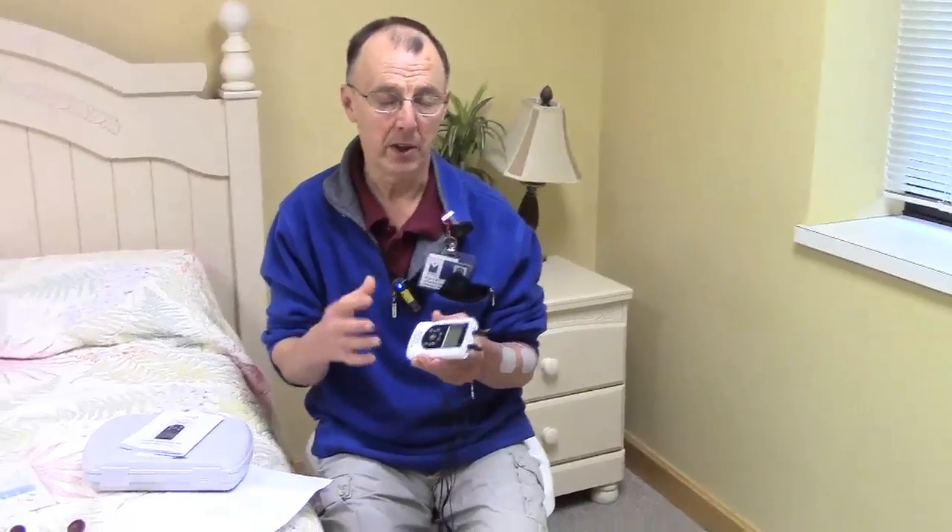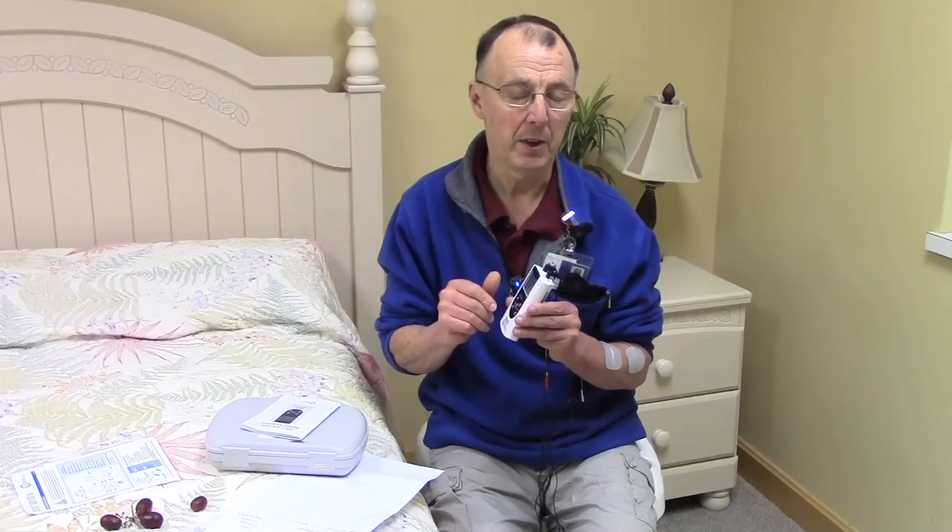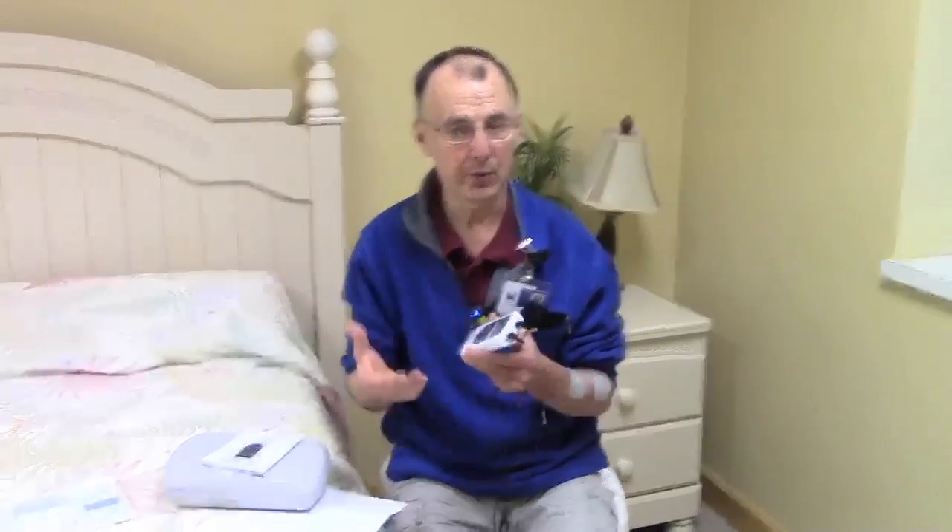Specifically in this video, how to help the muscles that open the fingers and close the fingers. In general, after a stroke or brain injury, you want to have a very comprehensive rehab program covering lots of areas. The research shows a good stroke program plus e-STIM will maximize the recovery.